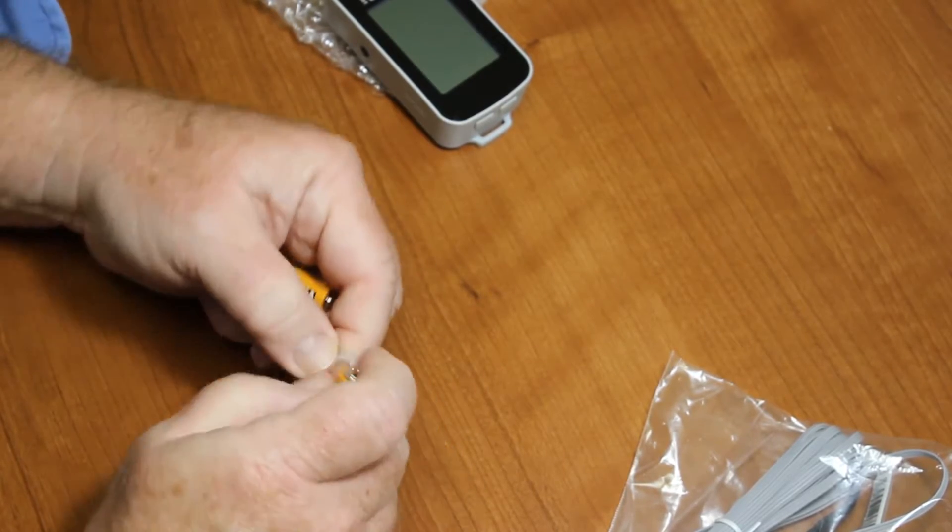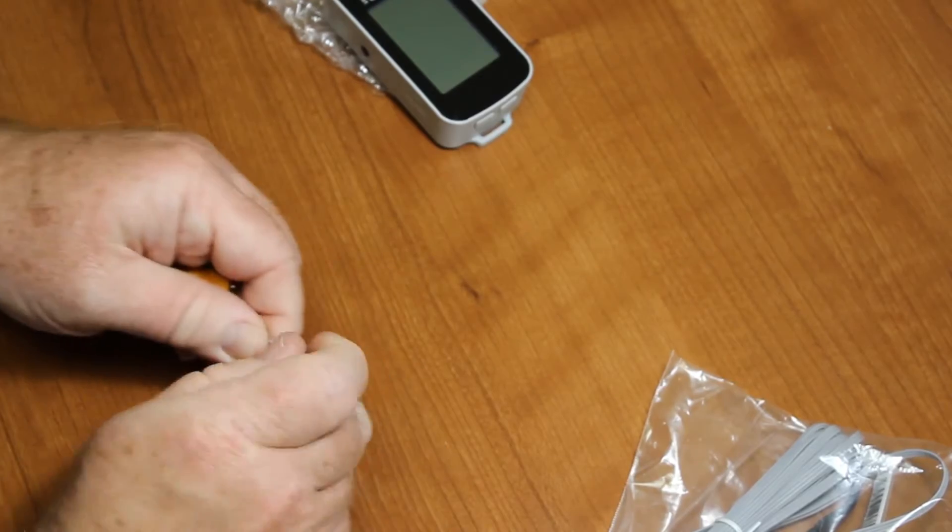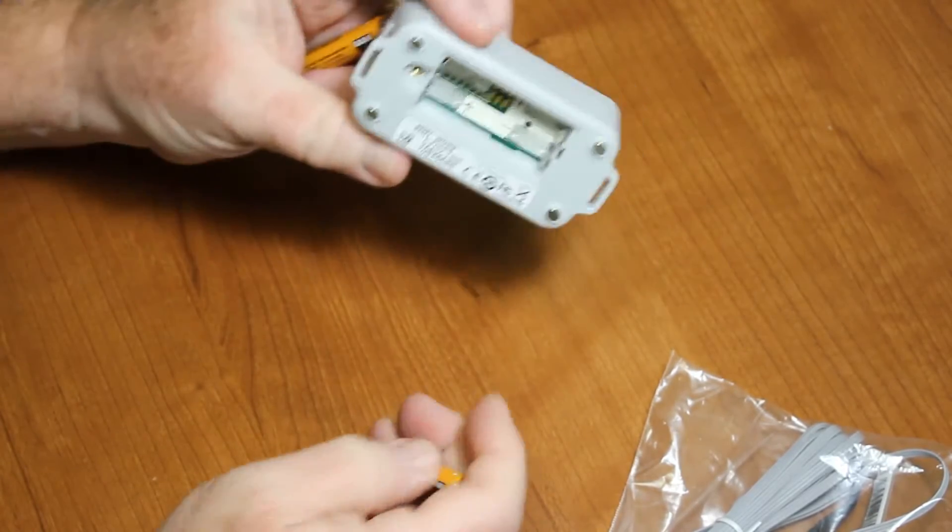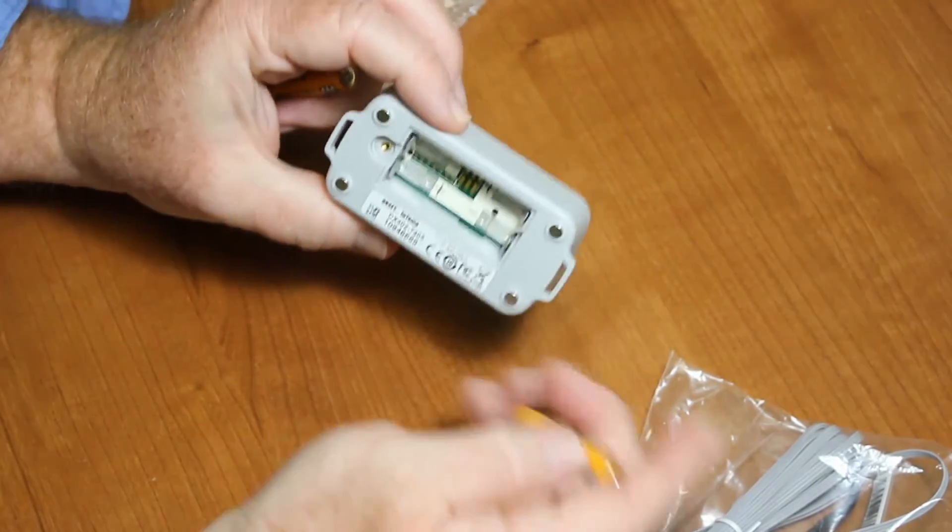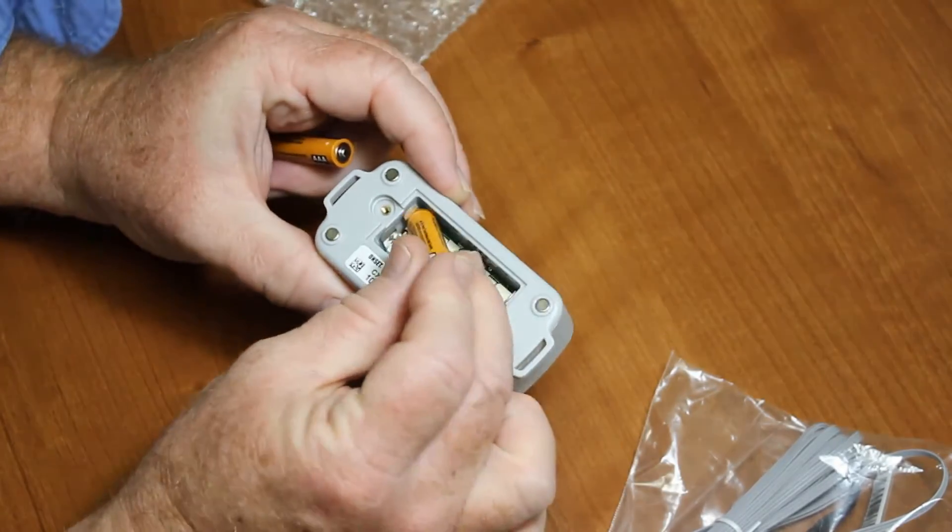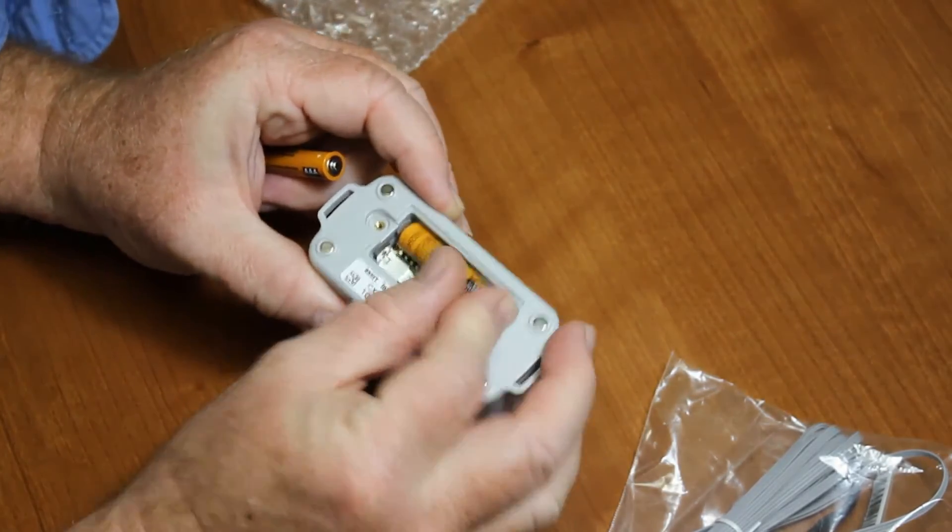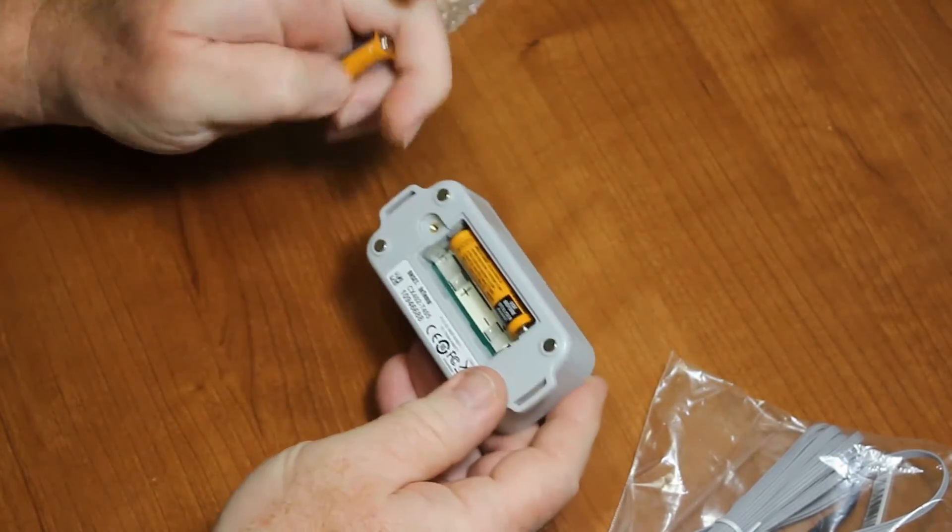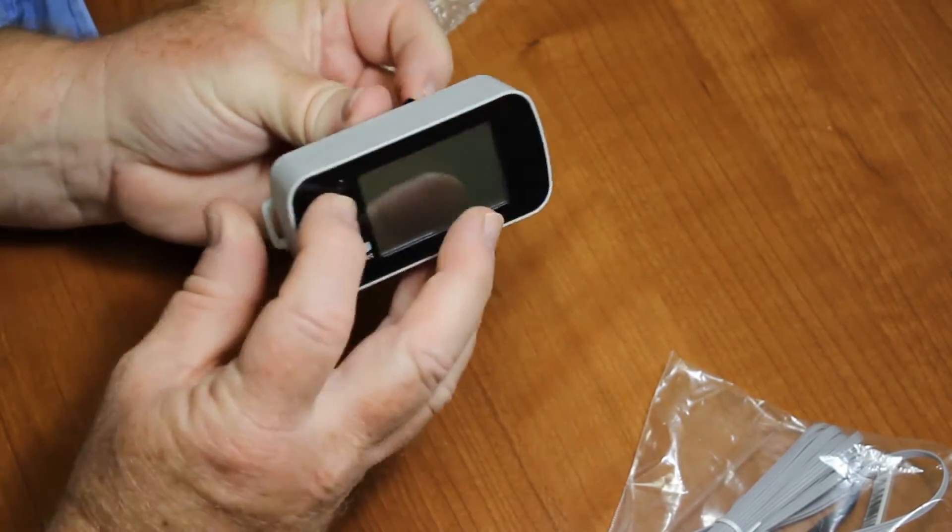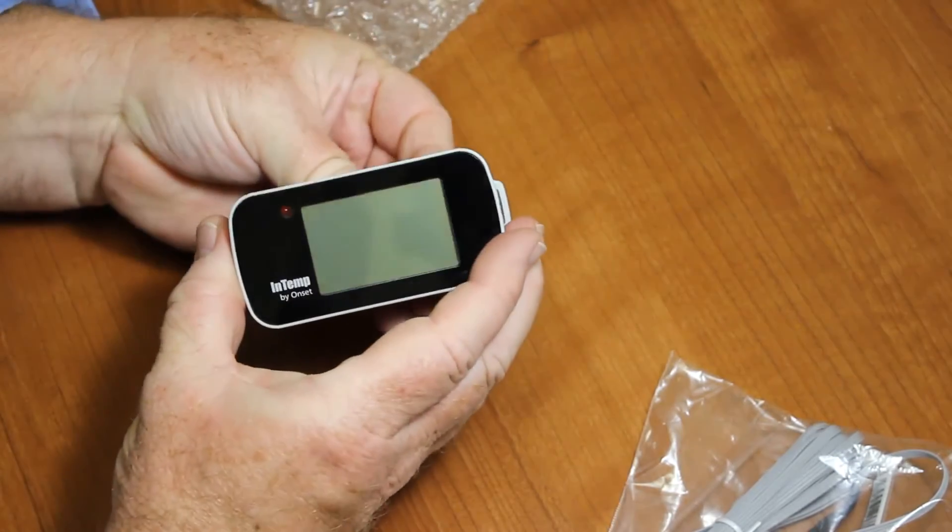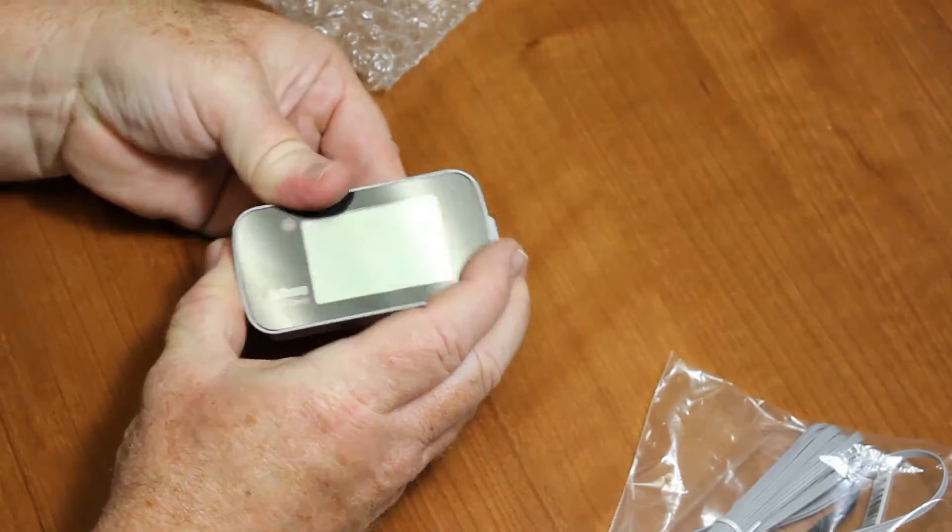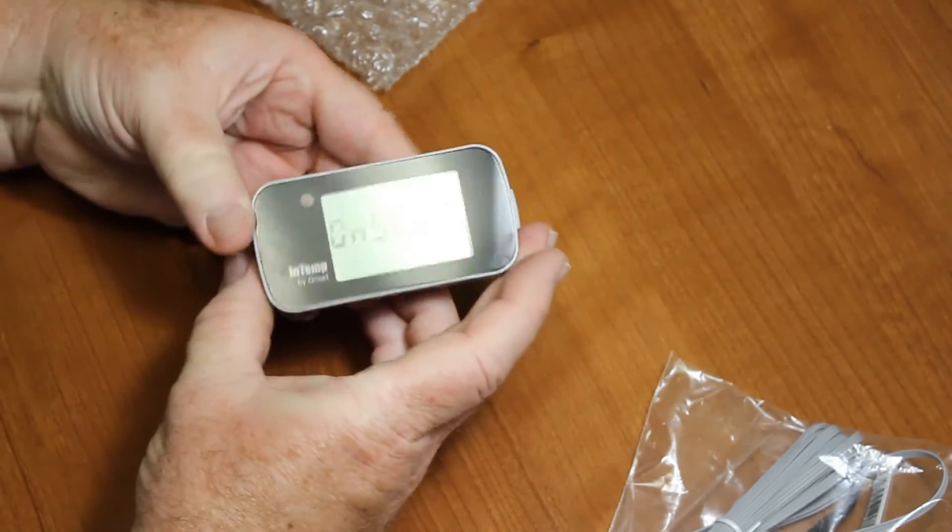The right polarity: plus to plus, minus to minus. Very simple. In the back it's marked as such. And when you put in the second battery, what you'll see on the front is it will light up and say Onset.